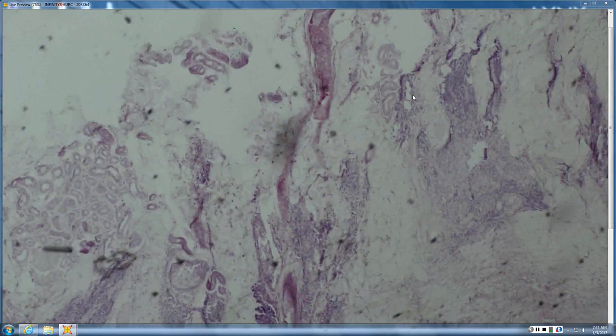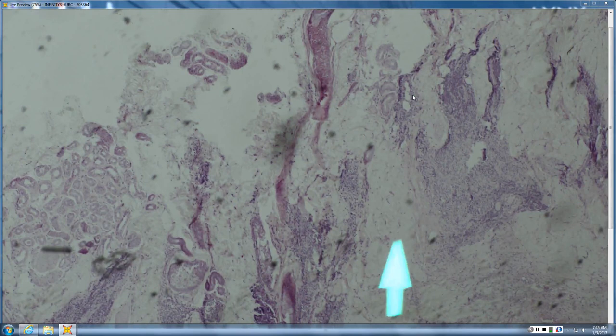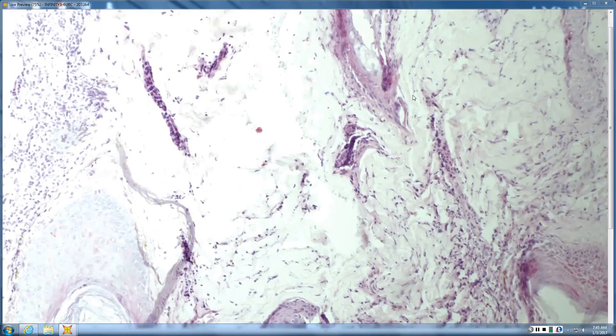So it looks like there's kind of a multifocal patchy infiltrate. I think that's what I'm seeing. I agree. Patchy blue infiltrate, and where is it tending to hit the hairs? It looks about like the isthmus, so deeper than the infundibulum. Okay, which would suggest lupus. And what's our stain? Probably not H&E, because we see lots of reddish purple glycogen. It's a PAS.